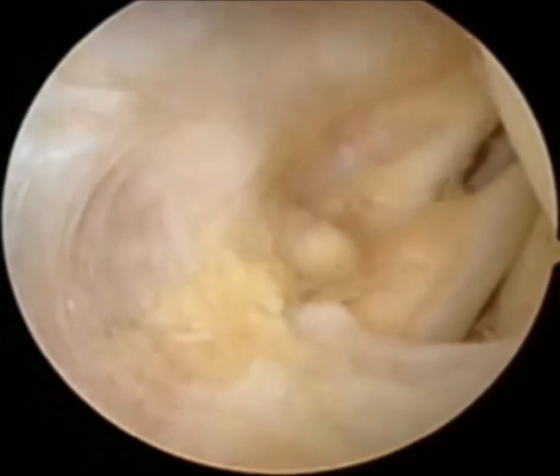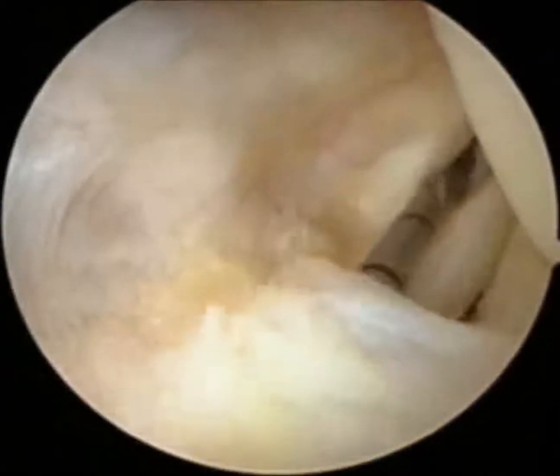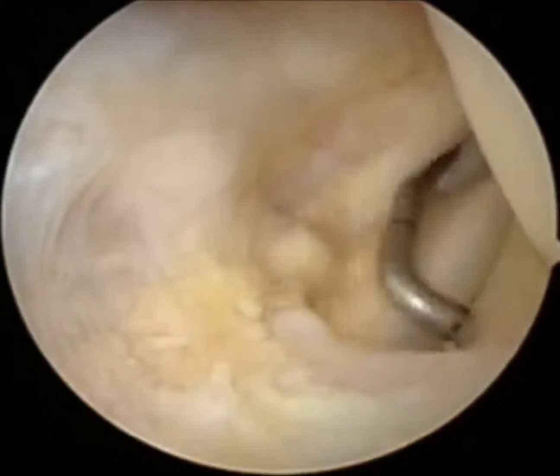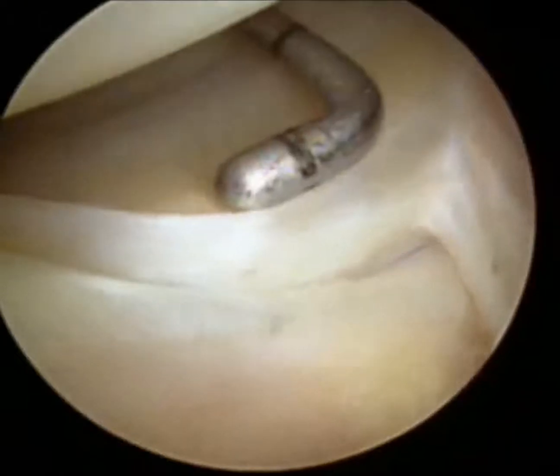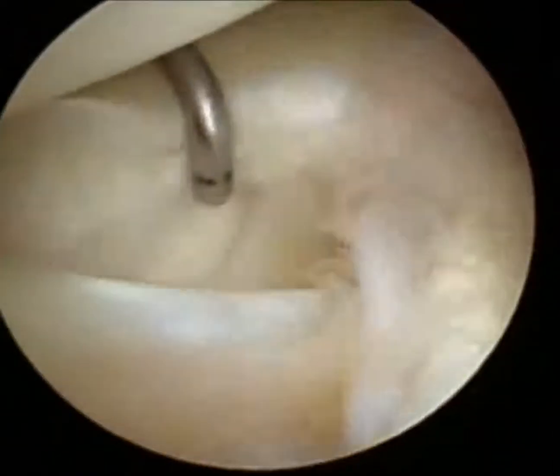The popliteal meniscal fascicle tear is checked again at the posterolateral compartment. Using the probe, we determine the laxity and tear length of the capsule. First, the boundary of the popliteal hiatus should be observed via probing.